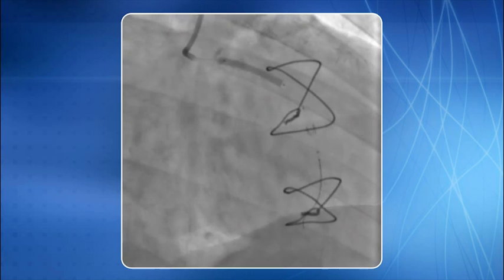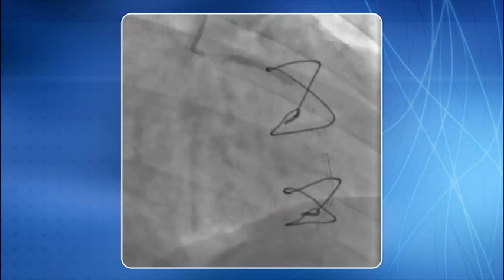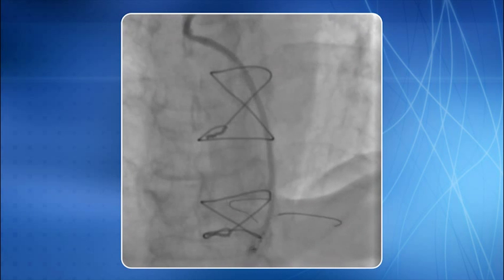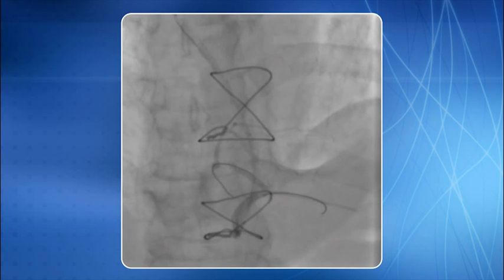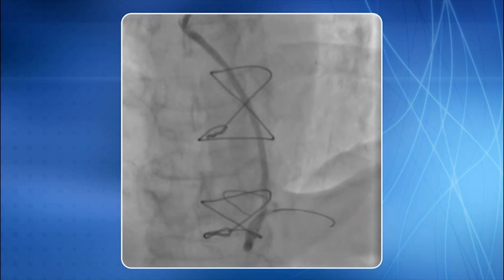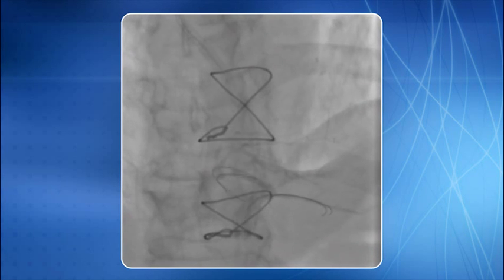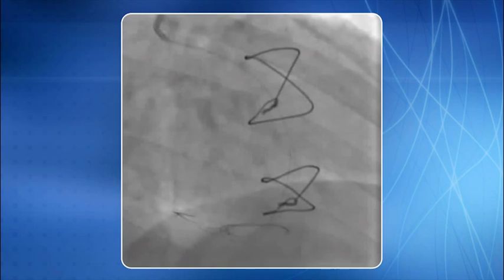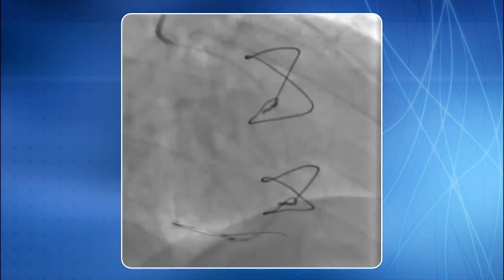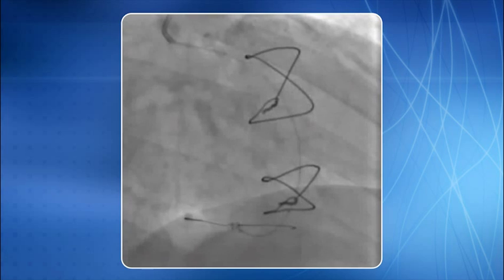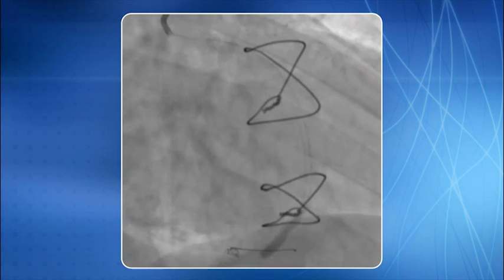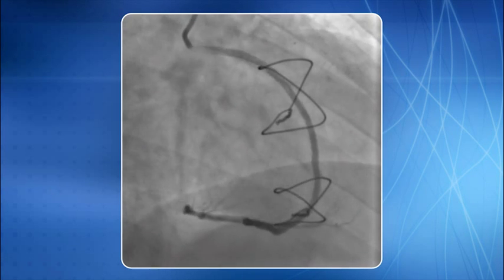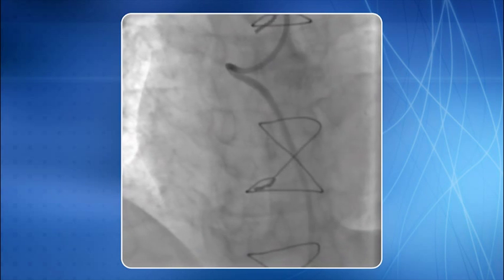The proximal lesion was stented with a satisfactory end result. We were then able to negotiate the distal protection device distal to the second lesion, because the resistance offered by the first lesion had been eliminated. The distal protection device deployment was successfully completed. Note that a buddy wire was required to negotiate the device distally. The second stent was successfully deployed, with a good end result.